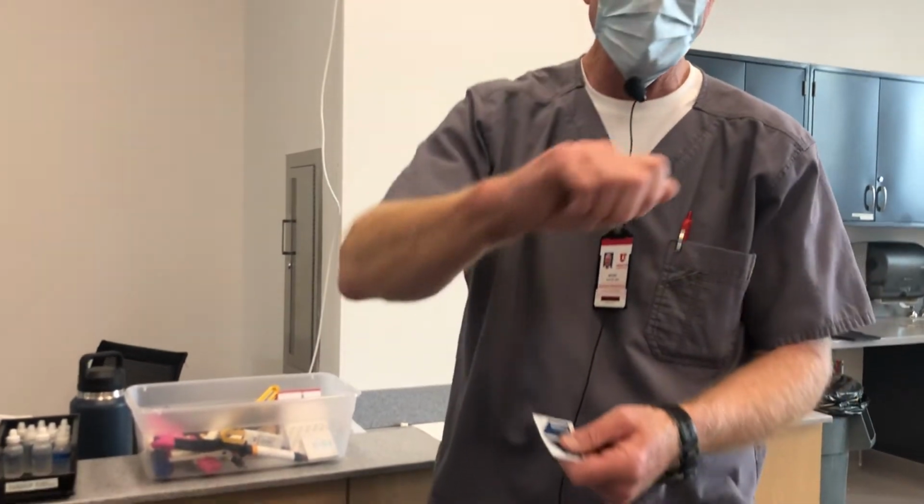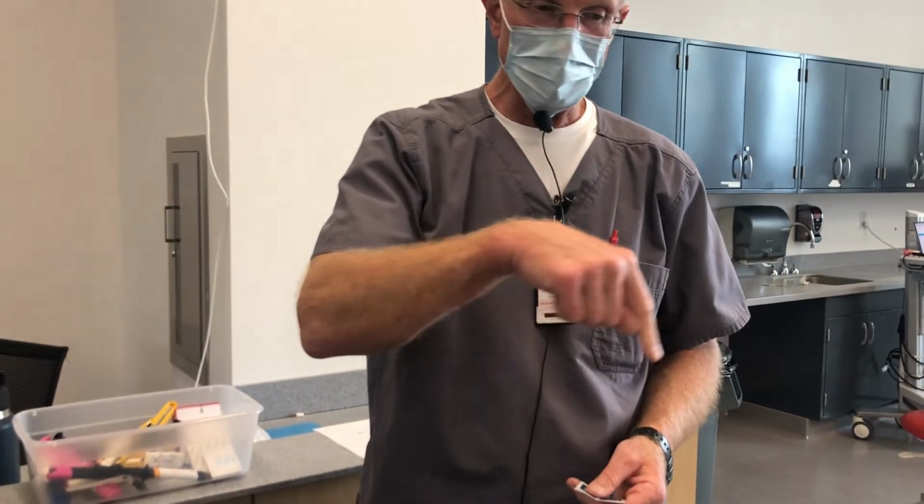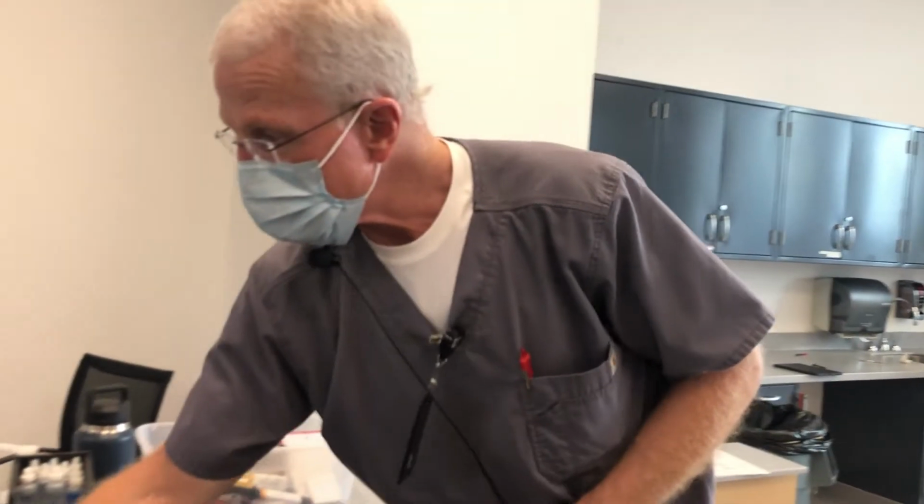But paste, easy to mix, you just incorporate both. Again, if I'm cementing a final crown, I load it up. If I'm cementing a temporary crown, I often just put it around the margins, not a ton, because I've got to clean it all up. I want it sealed at the margins, and I want enough to hold it in place, but I don't want to make a big mess either.